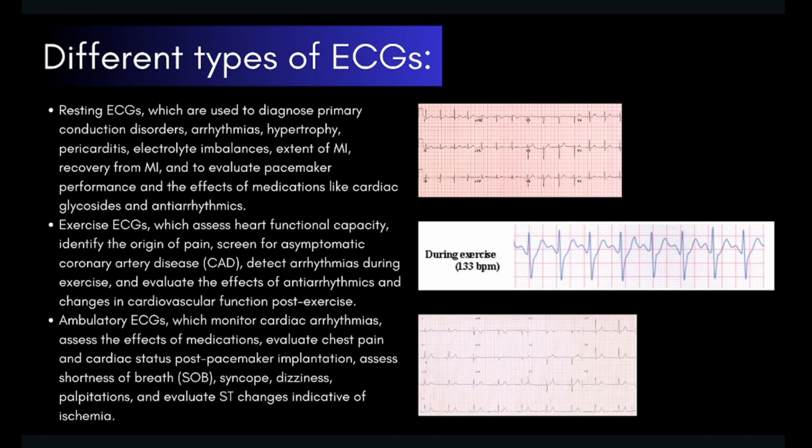Next, we have ambulatory ECGs, which monitor cardiac arrhythmias, assess the effects of medications, evaluate chest pain and cardiac status post-pacemaker implantation, assess shortness of breath, syncope, dizziness, palpitations, and evaluate ST changes indicative of ischemia.